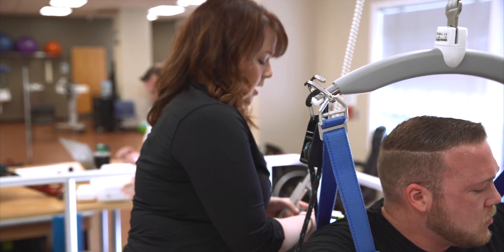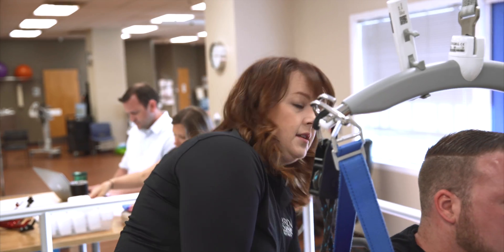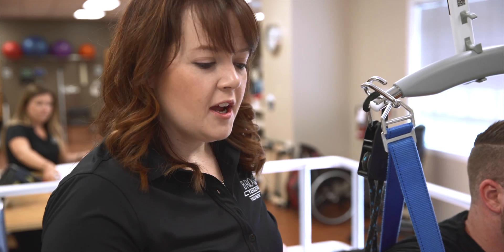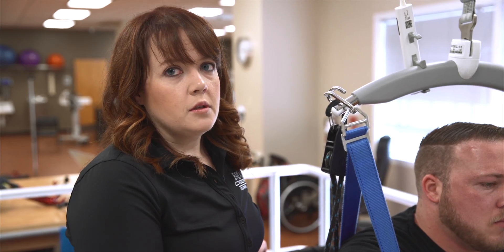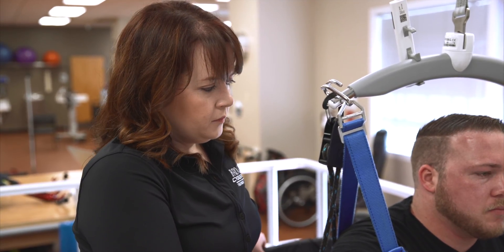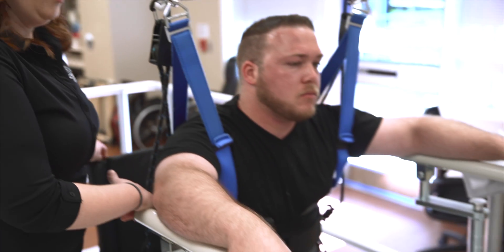I can see in the pattern on the screen when his signals are starting to fatigue — it gets a little more erratic versus that good timing that we want. We want to make sure we take a break and let them recover. It varies from person to person and activity to activity.